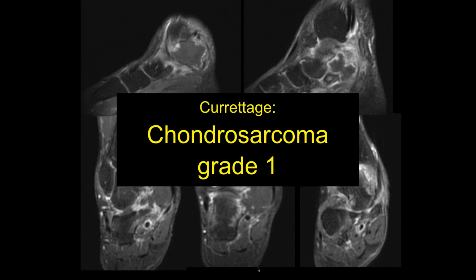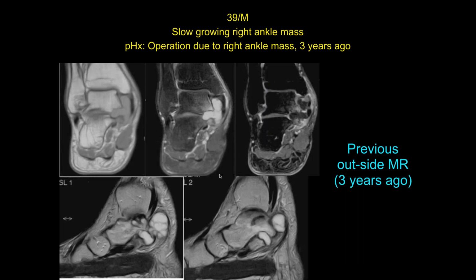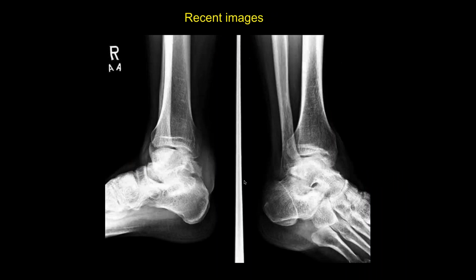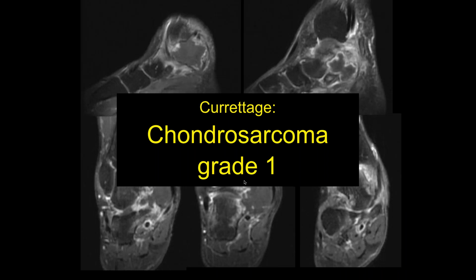So it's hard to determine. I don't think we can accurately differentiate between benign and malignant in a lot of these. This is a pretty good sized mass, even back here, with maybe some erosion of the bone in this location as well. So I think in these you've got to have a very high index of suspicion. These larger chondroid lesions are fairly uncommon, fortunately.